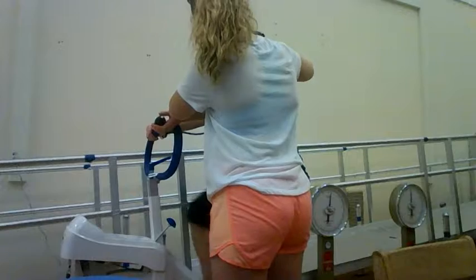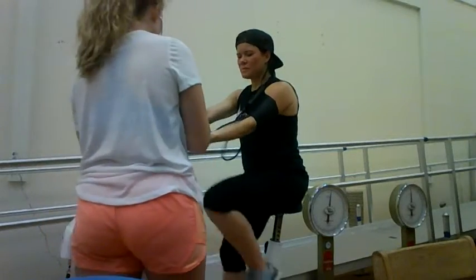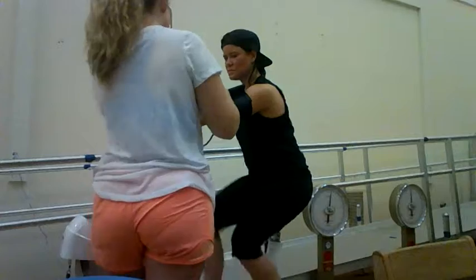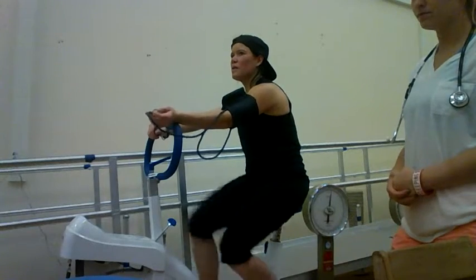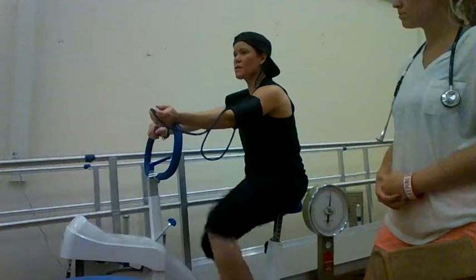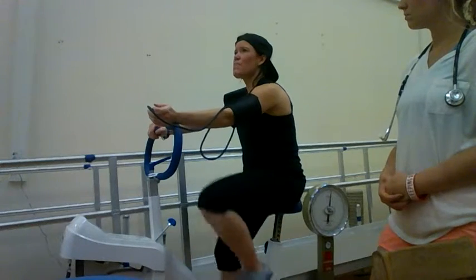Again, we must remember that the subject is trying to keep the cycle ergometer at 60 RPMs. It becomes more and more difficult to keep at 60 RPMs with the higher workload. The subject reached the 70% threshold of her maximum heart rate, which was 130 beats per minute. We have now reduced the kiloponds to no resistance, and the subject is now recovering.